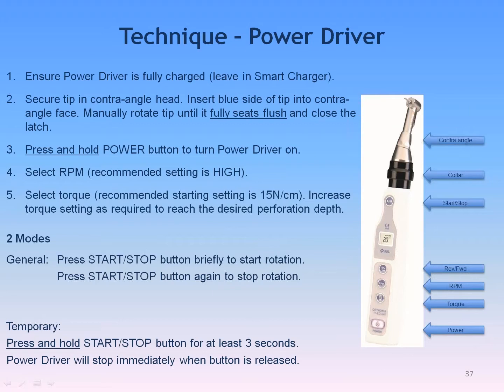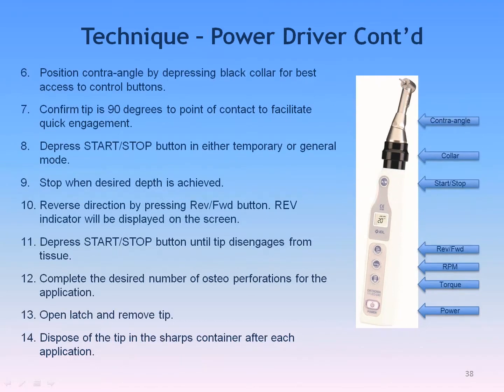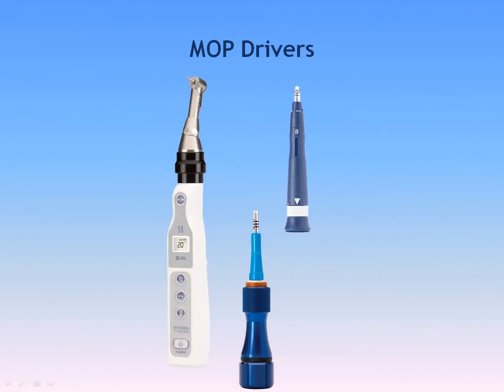You can use light, gentle pressure because the torque on it is wonderful to be able to place the right depth that you'd like to. But the other nice thing that I really like about this is that it's easy to make sure that you've got the angle directly at 90 degrees in all the different 3 axes of movement. So it's easy for me to center it and make sure I'm going in the right direction, go slowly, and put my small dimple in the tissue and back it out easily. These are just the steps, again, that we use when we're looking at it.